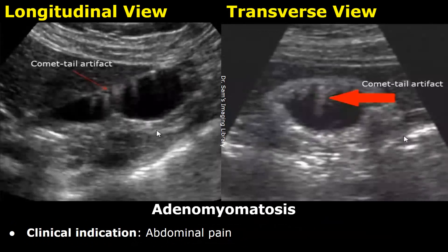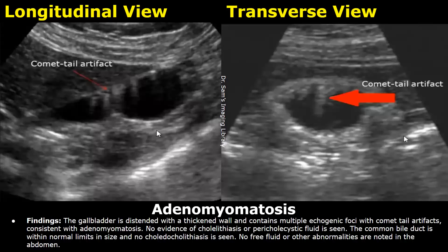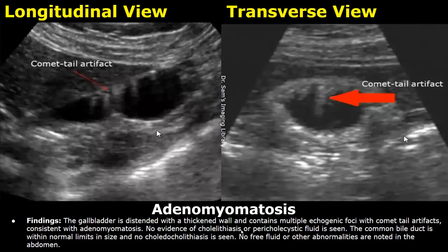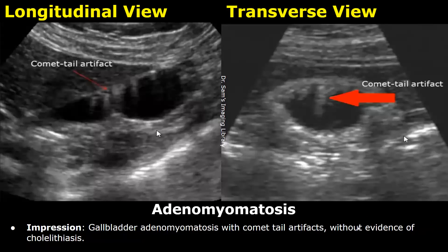Here is a case of adenomyomatosis. The clinical indication is abdominal pain. In the findings, you can write about the distended gallbladder with thickened walls containing multiple echogenic foci with comet tail artifacts, consistent with adenomyomatosis. Then you can write about gallstones or if there is any pericholecystic fluid. For this case the impression was gallbladder adenomyomatosis with comet tail artifacts without evidence of cholelithiasis.